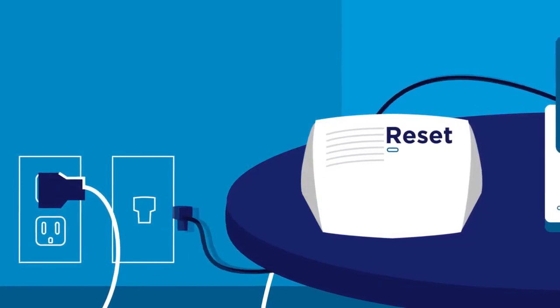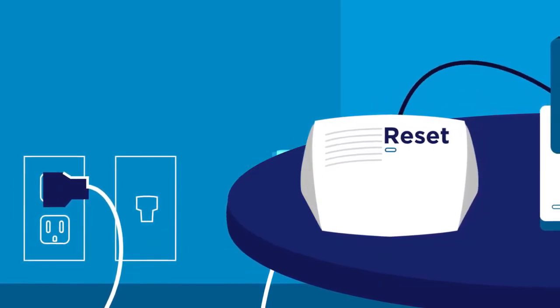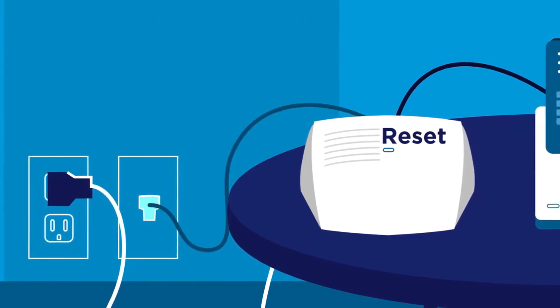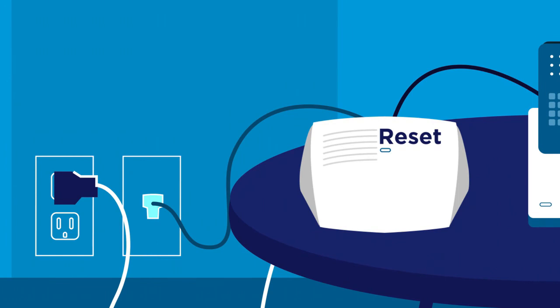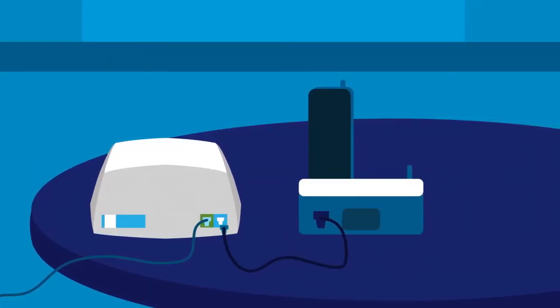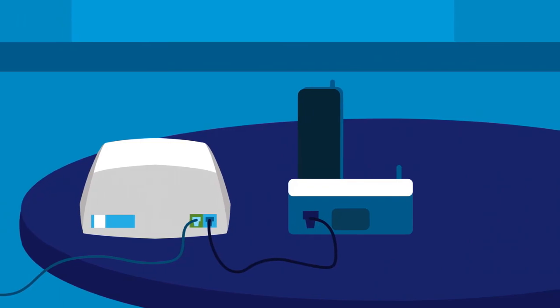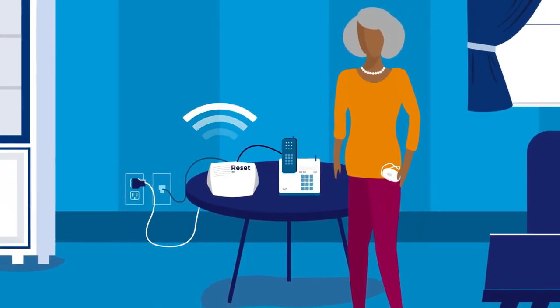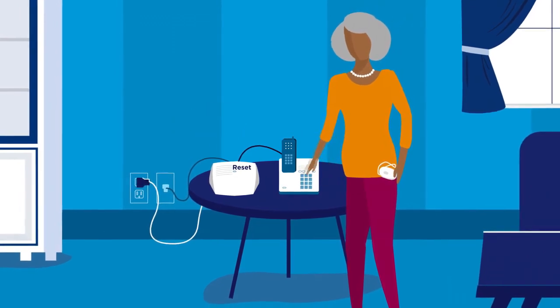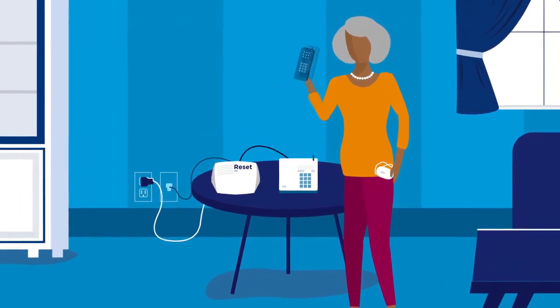Now unplug your landline phone cable from the wall jack and plug the clear end of the phone cord that came with your home communicator into that wall jack. Then plug the cable from your landline phone into the blue jack on the back of the home communicator. The home communicator will say, good, your communicator is now plugged in. If you've completed this step correctly, you should hear a dial tone on your phone.